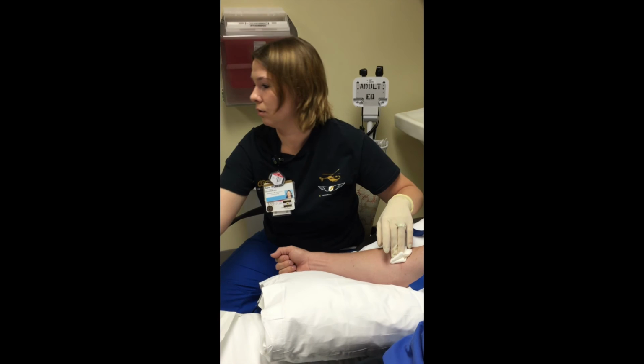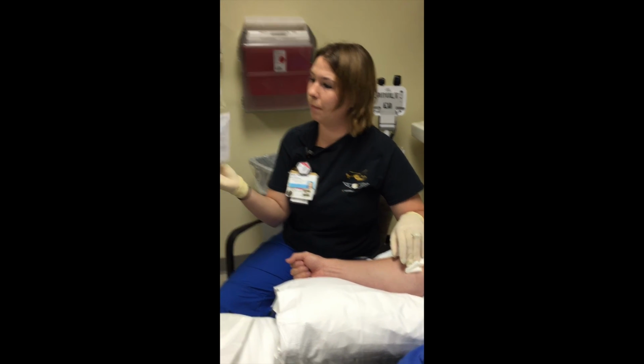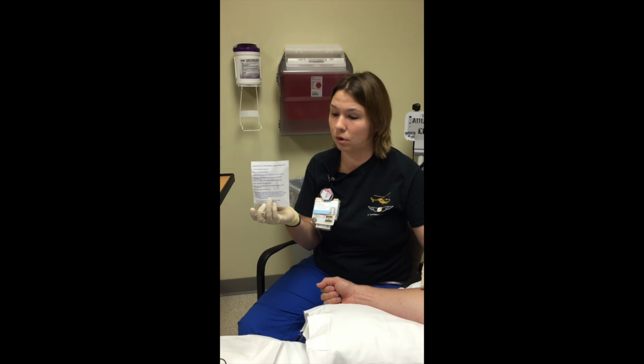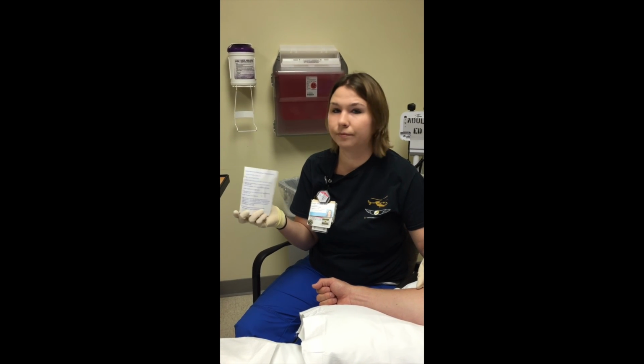If you ever forget how to do or the order of doing things, in the bottom of each of the kit, there's actually instructions for blood culture using the sterile kit. So if you have any questions, please refer to this or ask one of your hall partners or the CSL or RSL on duty. Thanks, guys.